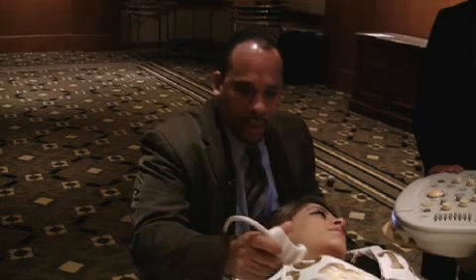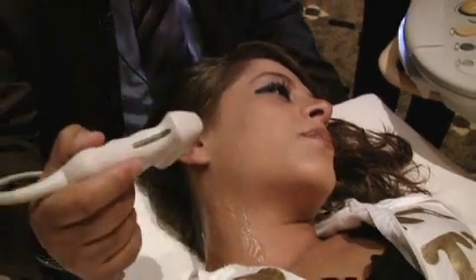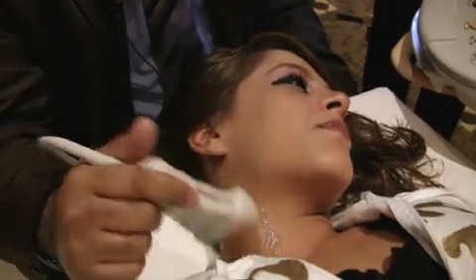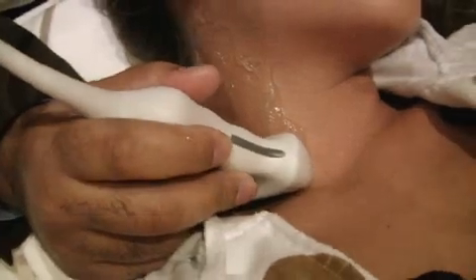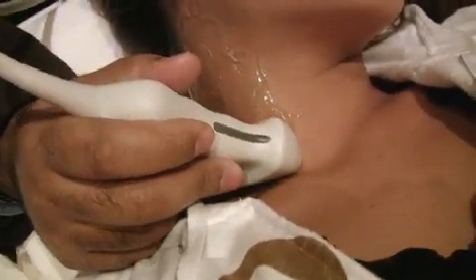So let's get started. Here, what we're doing is using an L9-3 transducer, really the workhorse for carotid artery testing. We're going to start out the evaluation at the base of the neck, as far down as you can go, identifying the origin of the common carotid artery. The anatomy is a little bit different on the right than it is on the left, and on the right, you can almost always identify the origin of the common carotid artery.